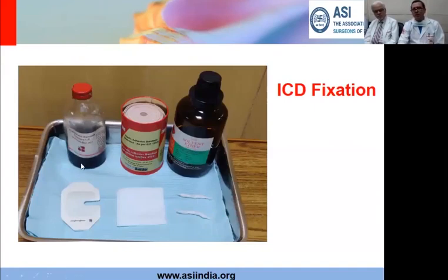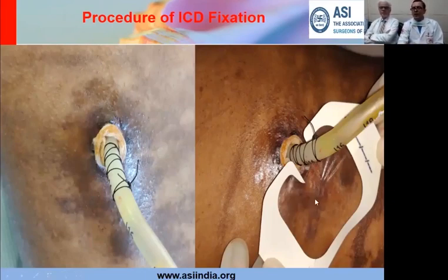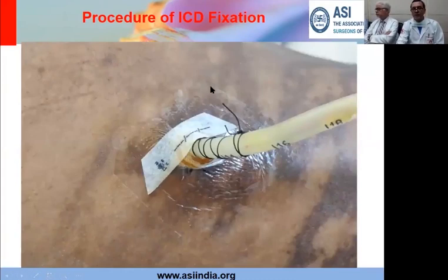I just take some cotton and a little tincture benzoin, and first we put this tincture benzoin soaked cotton around the tube. If you leave it for some time, it sticks to the skin and forms a very nice snugly fitting layer around the entry point of the tube. The next thing we do, we take a sterile dressing. Now this is a Tegaderm dressing. Any of the sterile dressings usually available for IV site dressing, you can take and put around the chest tube at this point. As you can see, we put one this side and one this side. So from here to here, this chest tube entry point is sealed in a sterile manner.